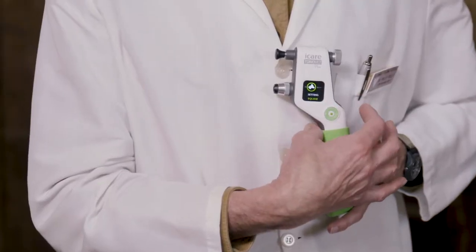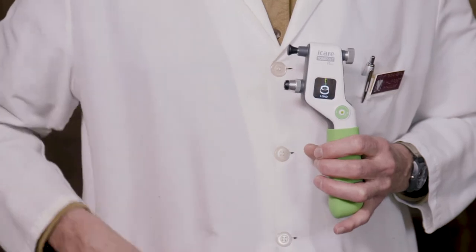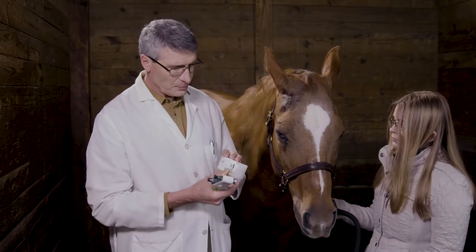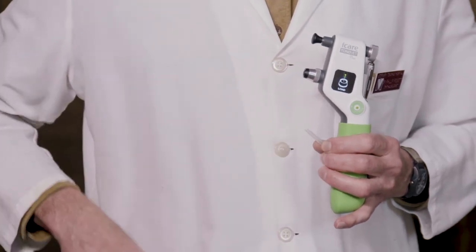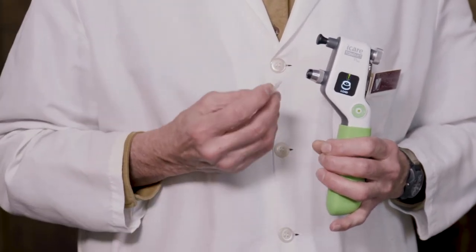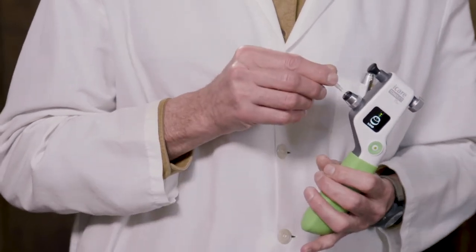When we activate this, it will tell us that we need to load the instrument. This is where we're going to load these little pins that come in separately wrapped sterile containers. Here we have the container — I'm going to take the top off and basically just drop this in.